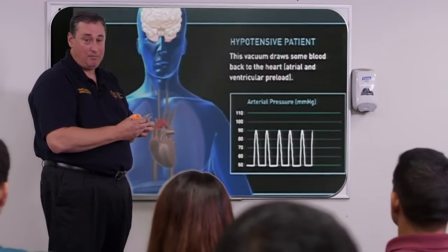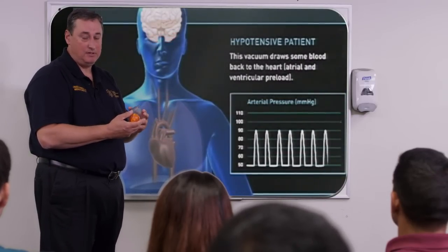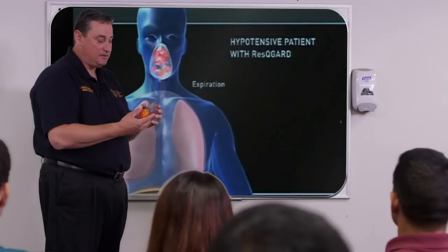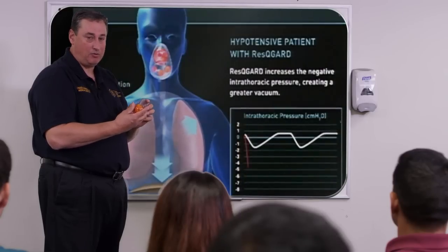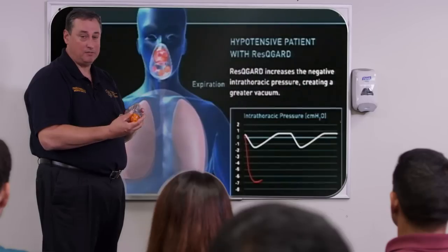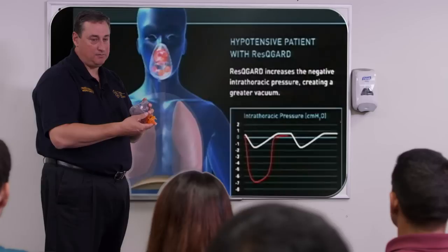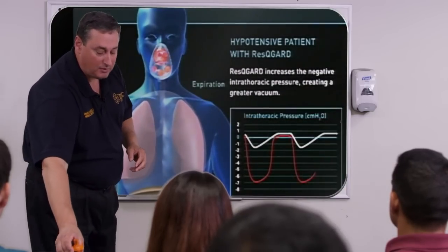Again, it can be simply placed over the patient's nose and mouth, and the patient breathes against this. When we think of CPAP, that's kind of the opposite of the patient that we would put this device on. CPAP is continuous positive airway pressure that is actually blowing air into the patient's lungs. This device is a one-way valve that, again, increases that negative intrathoracic pressure and thereby helps increase a patient's blood pressure. This can be simply, quickly, and efficiently applied on the spontaneously breathing patient's mouth and nose to increase the patient's blood pressure.